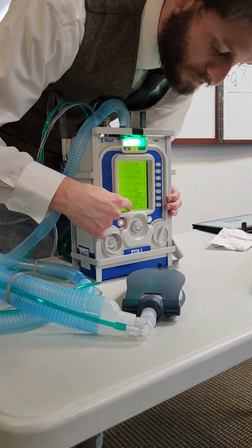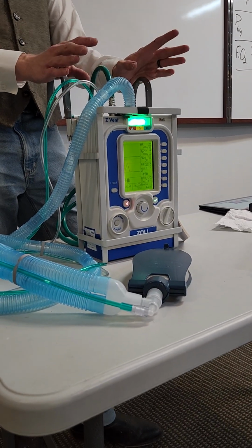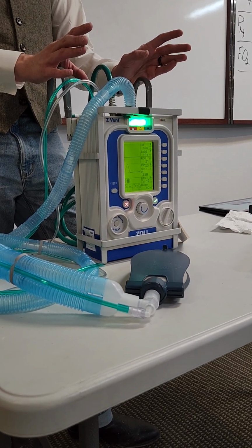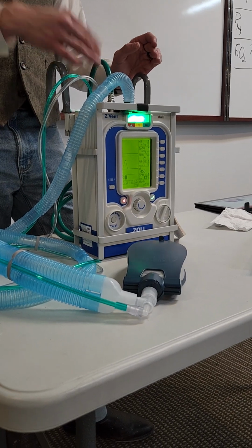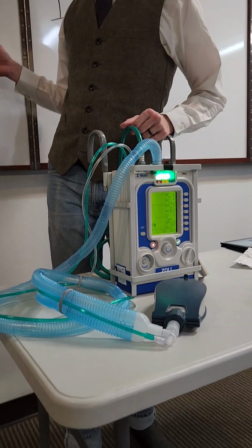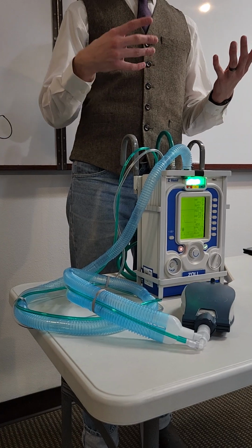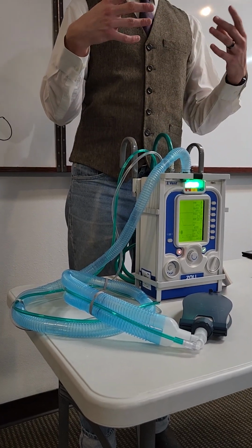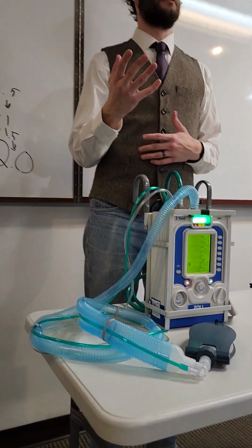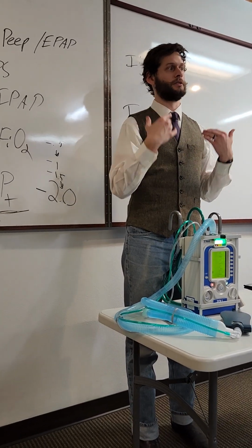Okay. This one also selects the trigger as -2, which is okay because we're not looking for a patient to breathe over the vent so much in AC/VC. And obviously, like I said before, if you set it too low, so let's say we're like, oh yeah, the trigger is -2, we need to put it down at 0.5. Like I said, it might be that in the rig, a bounce or something like that, someone bounces a little bit, it might change the pressure in there enough that it initiates another breath. And, you know, kind of like with pediatric patients, if you're breathing for somebody when they don't want to be breathing, you could cause damage to the airway.